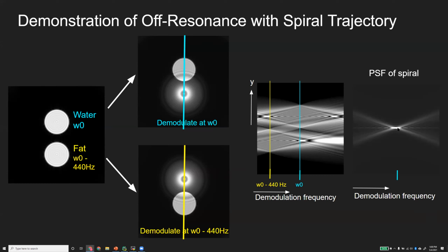And so in general, for off resonance effects, each voxel in the image will have a different point spread function because it can have different material. Like this, if the material was fat, for example, then this point spread function would shift a little bit. So you have this spatially varying convolution because of off resonance effects.